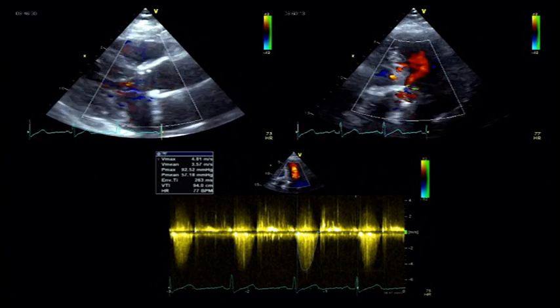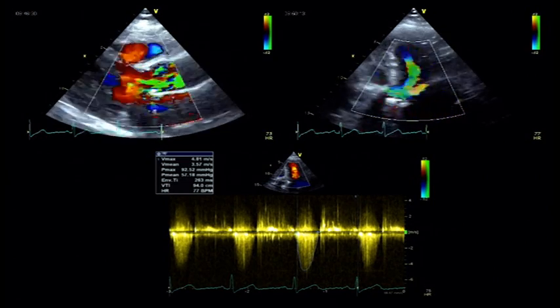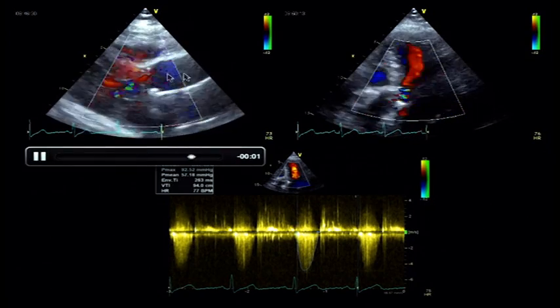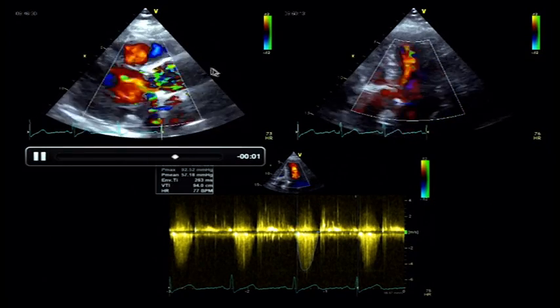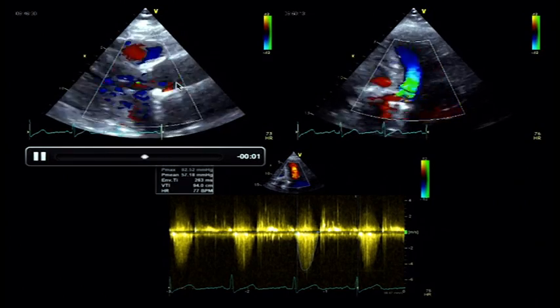And lastly, one more patient. This patient, again, had a bicuspid aortic valve, and then he also underwent a Bentall because of aortopathy. He had a large ascending aorta, and this was about 4 or 5 years back. And for about 2 weeks, he started to develop breathlessness, and then it suddenly accelerated over the last couple of days. And you can see here that there's a lot of turbulence at the aortic valve here, and then you can see very high gradients, a mean gradient of almost around 57 here.